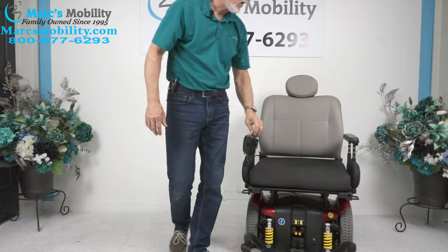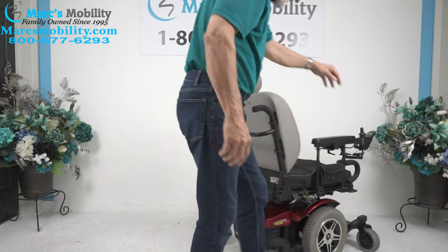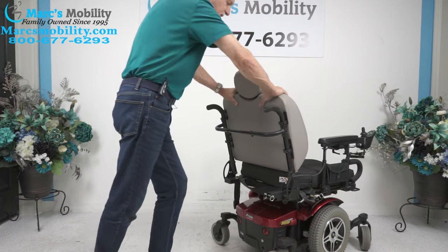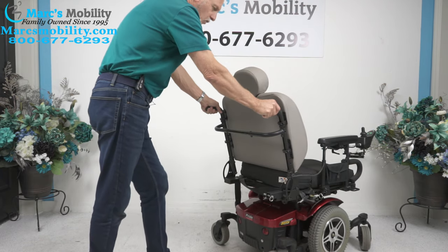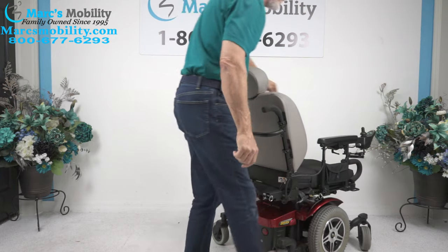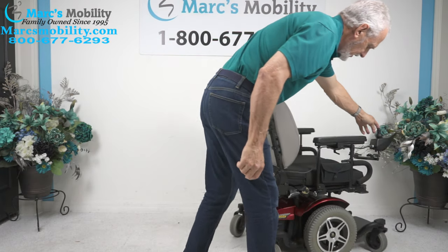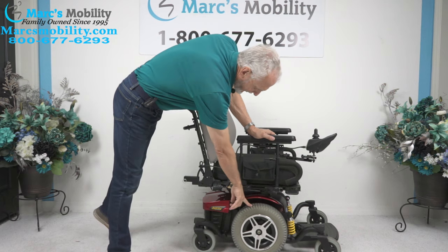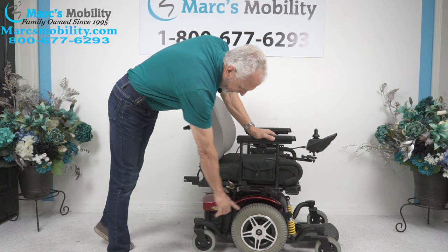On the back of this chair it has a push bar, so if you ever had to push this chair around, you don't have to do it from the seat — you have actual push bars. Again, this is the Jazzy 614 HD, and it does come with 14-inch solid tires, with caster wheels in the back and caster wheels in the front.